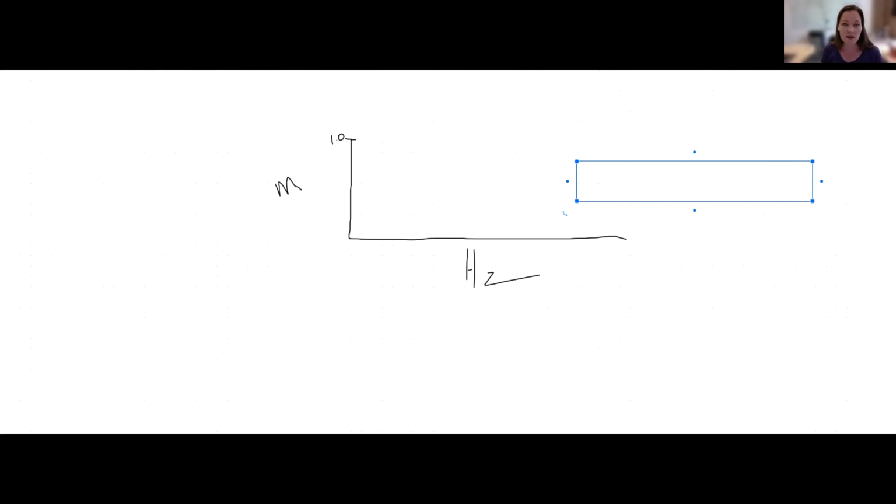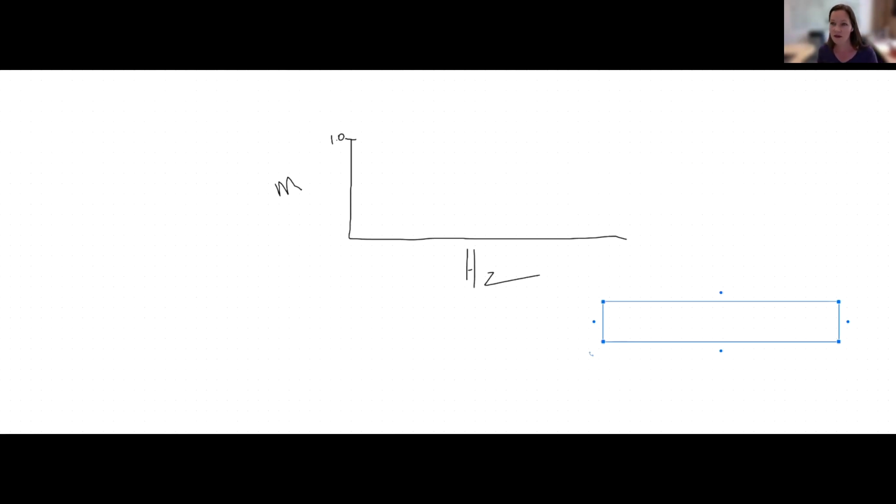So you need to know something about the frequency characteristics of your signal and the likely frequency characteristics of the noise that you're trying to filter out of that signal, right? Some common sources of noise that we have to deal with in filtering are motion artifact. Sometimes when we have EMG electrodes on people, it's more problematic with wired systems because wires act as an antenna, and when they move, that causes motion artifact in the signal. So you can pick up motion artifact.